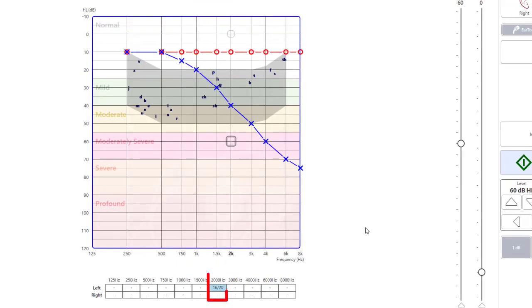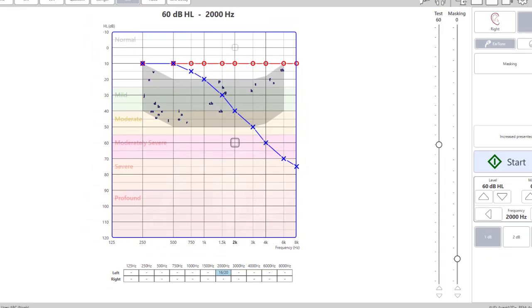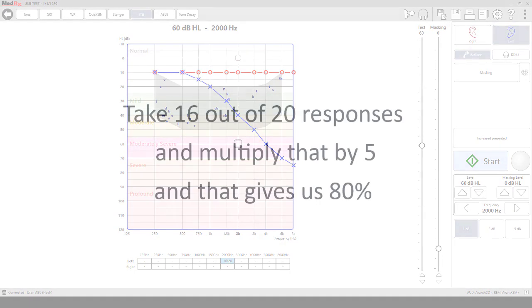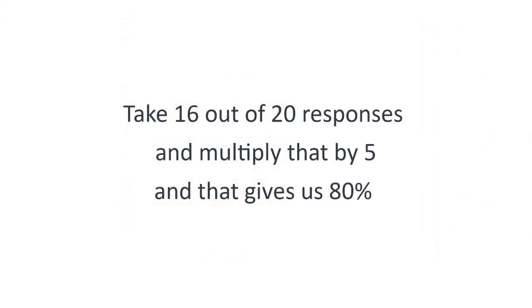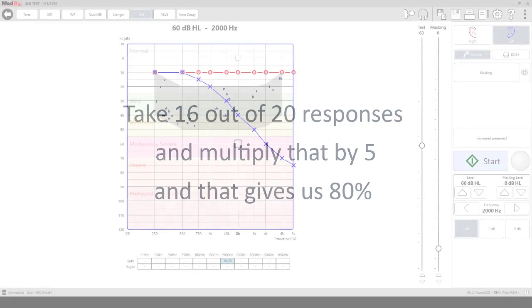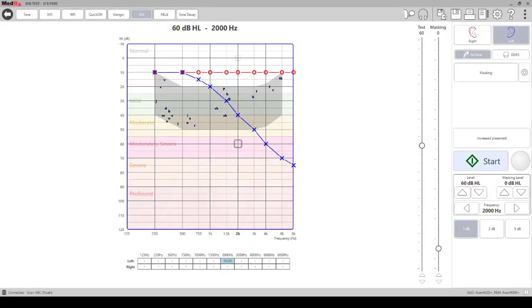Now that you see that 20 presentations have been completed, we will then want to take in this case the 16 out of 20 responses and multiply that by 5, and that gives us 80, a percentage of 80. In this case because the patient has a high percentage of signaling that they heard the increase in intensity, that shows that there's a cochlear pathology because of recruitment there, and we want to then proceed as if this were a cochlear hearing loss.